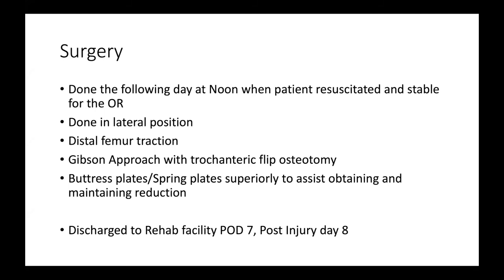And if you hold it in that position, it usually requires two people to prep because somebody's got to hold it. And I think you can minimize the potential for additional soft tissue injury. Maybe it's not that much, but the prep is very difficult for these, I think, because the head's moving around and sometimes you can hear things you don't want to hear in the process.